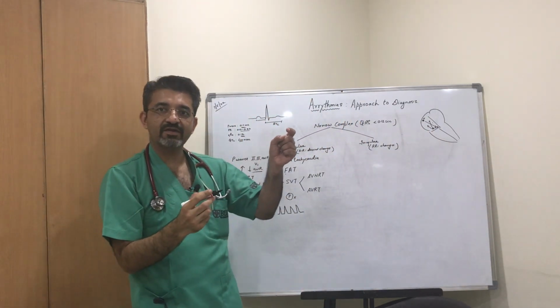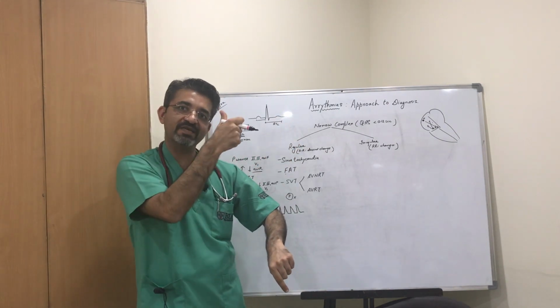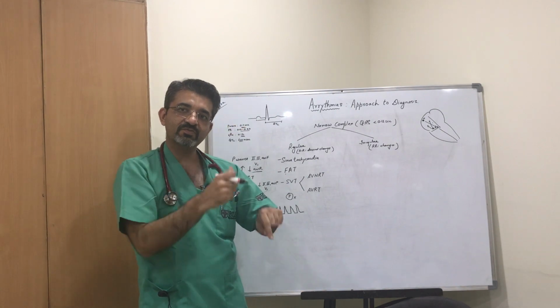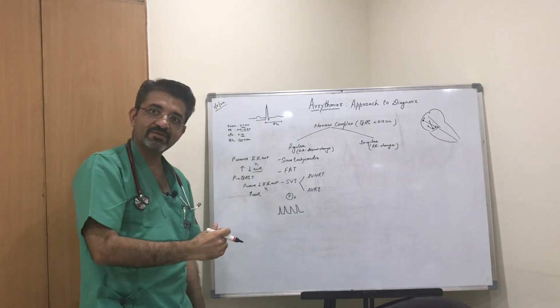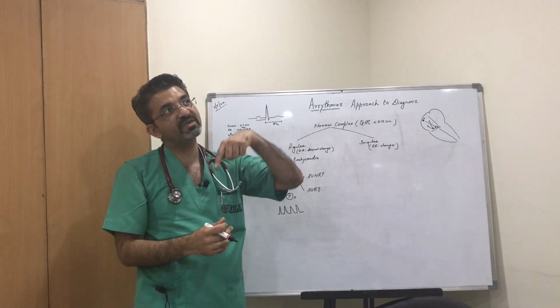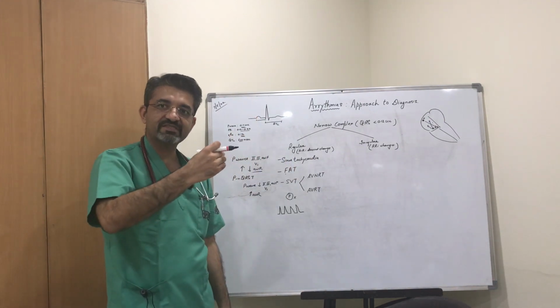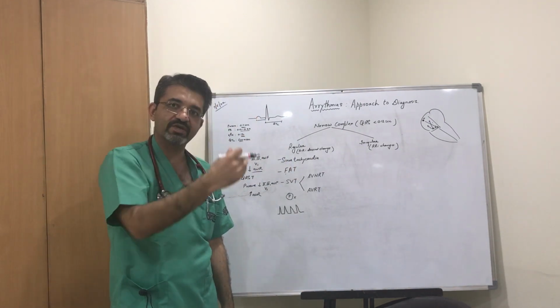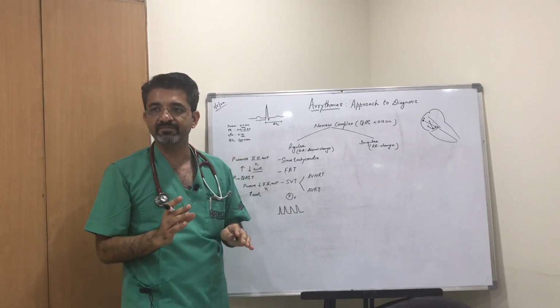So one beat will be transmitting towards your ventricle and one will go up simultaneously. The transmission in the ventricular system is fast, so QRS will be coming faster. Then you will have a reflection of P wave which is going upwards. So you can have a negative P wave or you can have a slurred stroke in the QRS, which is in fact P wave. Very difficult to identify in ECG, but you can.